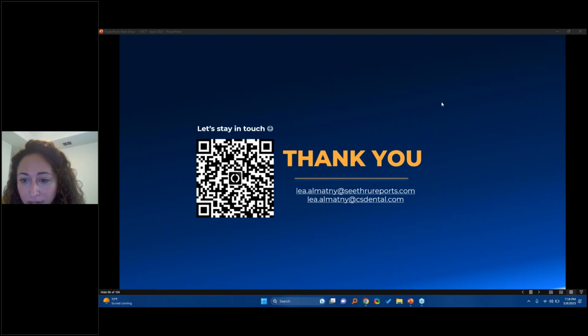Okay, do we have any more questions? Do you recommend the J Morita X800 CBCT machine? Actually, I really like the scans that come from the Carestream, specifically the 9600. The 8200 has really good image quality too, but if we're talking about endo evaluation and you're comparing these two machines side by side, the 9600 just has a much clearer and sharper view to it, without adding any thickness to the slices.